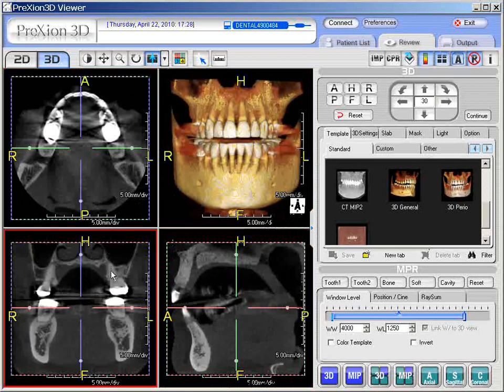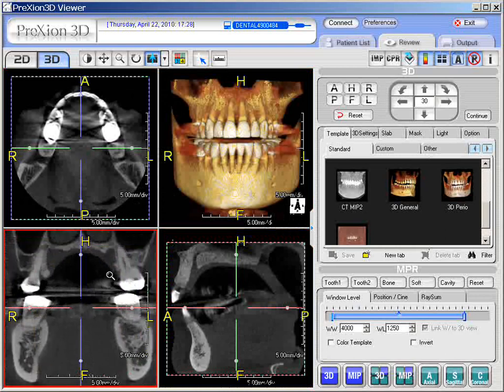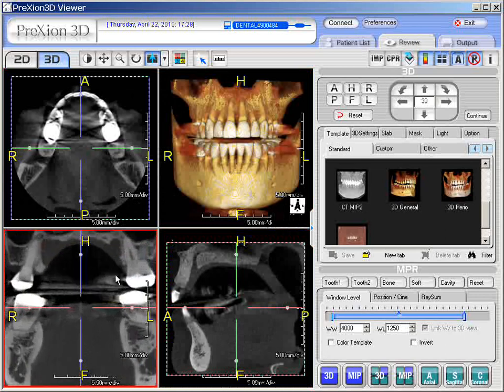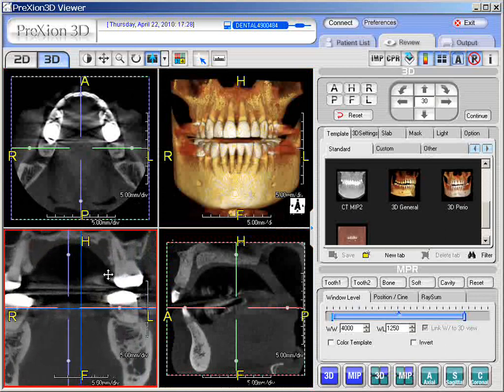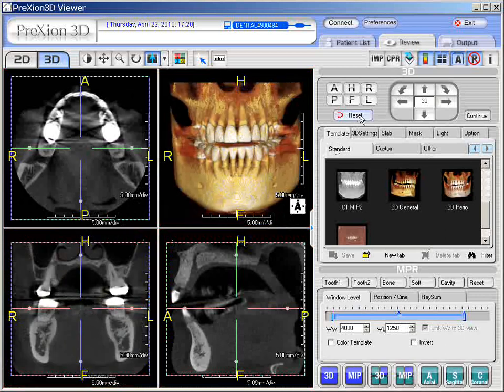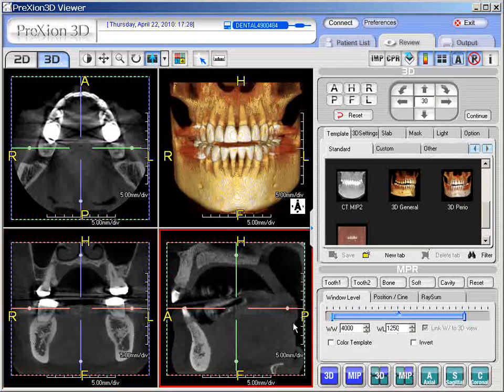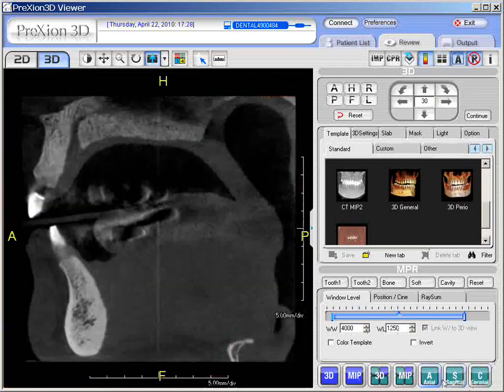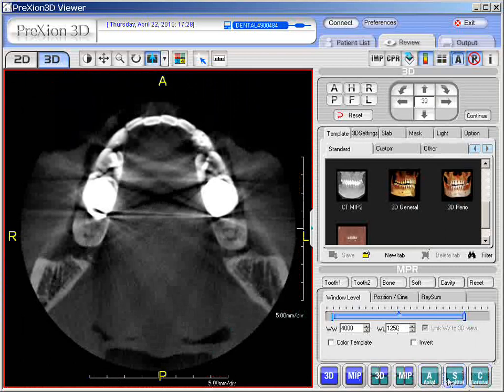If you want to resize the CT image, simply press down the middle wheel and resize your image using the zoom magnifier. The pan is the same — right click and you can re-center. Remember your reset button takes you back to the original position, or you have icons that can load up the particular screen that you wish.